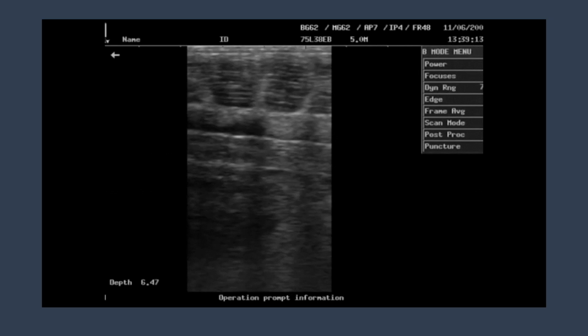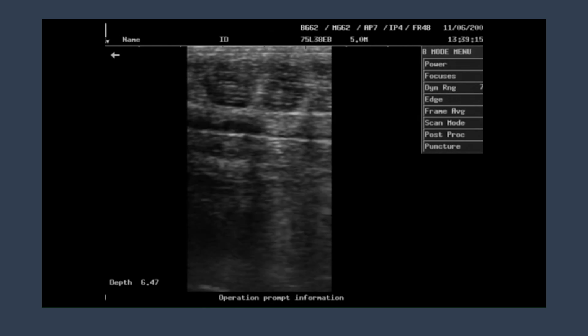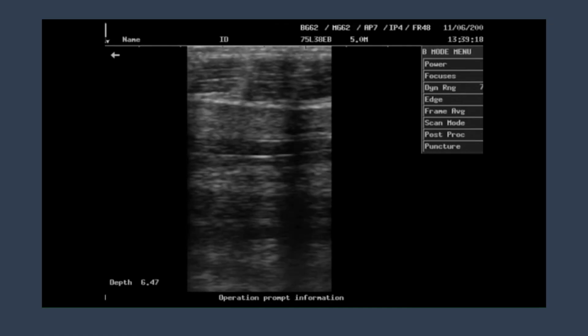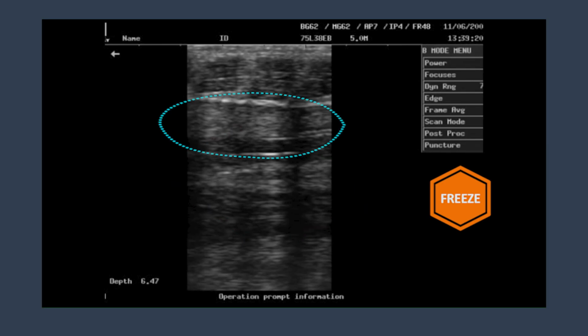Sometimes the cause of incorrect gender recognition may be interference caused by abdominal scutes. Bone tissue of scutes does not pass ultrasound, as a result of which an acoustic shadow is formed under them. Such shadows are visualized as vertical dark bands and are best of all noticeable exactly on light areas. In this area, these stripes are pronounced most distinctly and passing through the area of generative tissue, they create a visual effect of interruption of the light stripe and appearance of the cloud structure characteristic of females with gonads of the second stage of maturity.